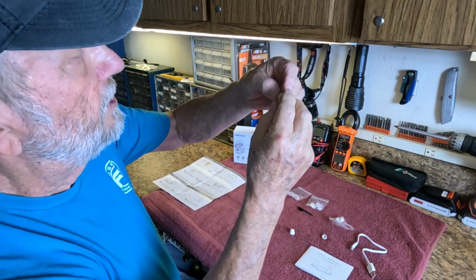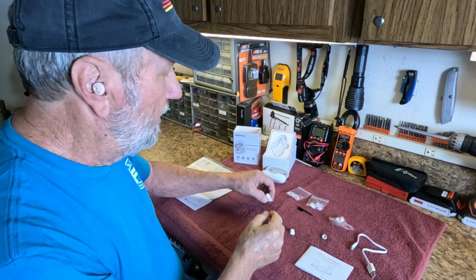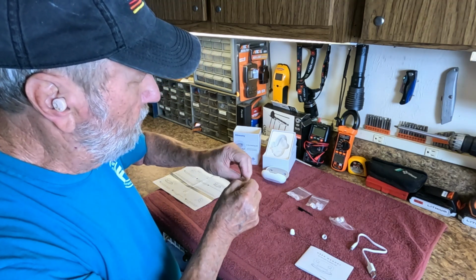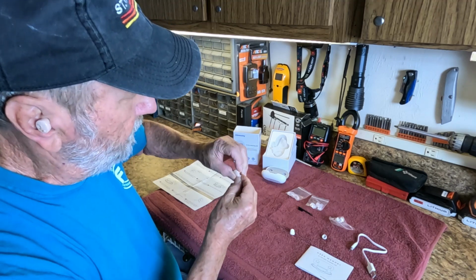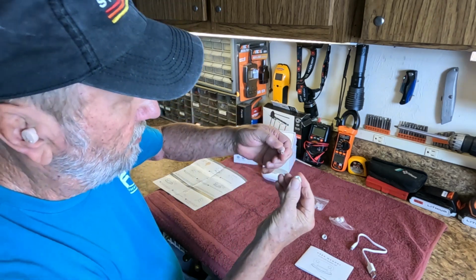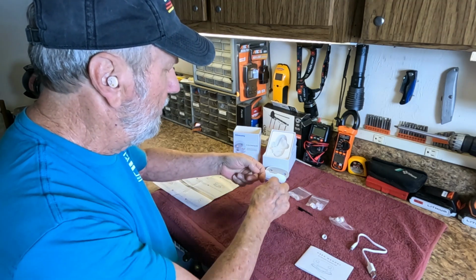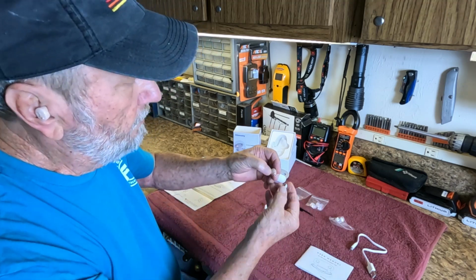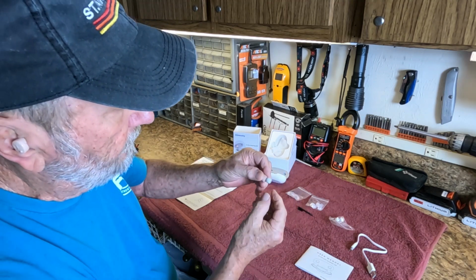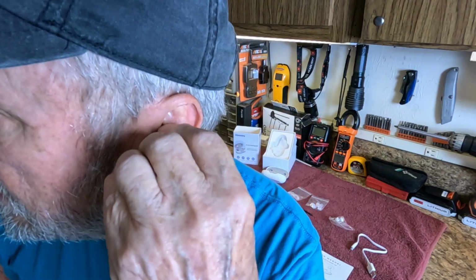The button goes down, microphone up. That's the right side. That does feel good. Okay, I'm going to take this one off, and you roll these back with your finger like this, so that it'll just peel right off. And then these can be reused at another time if you think you want to go back to them. And then this one, just put it in at an angle, push up, and you'll feel it snap in place. And then, again, the button to the bottom as I put it in my ear.